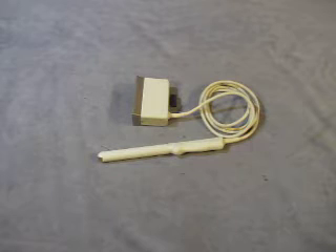For sale, we have an ATL ultrasound scan head. It's a curved linear array, C5 IVT, 5 megahertz.